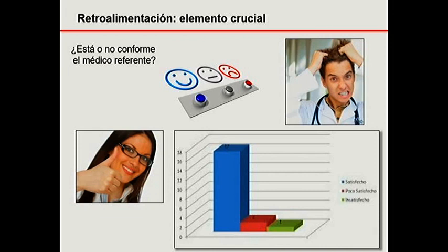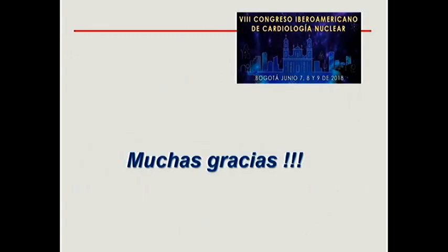And we need to find out a way to know if we're doing things right, find out what the referring physician is thinking about our work.